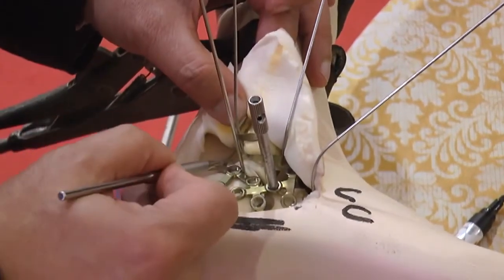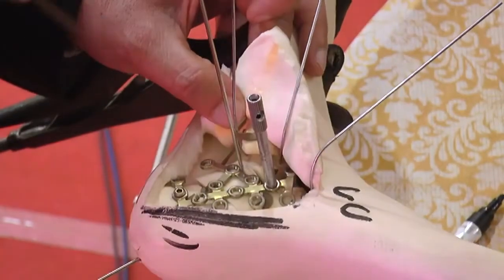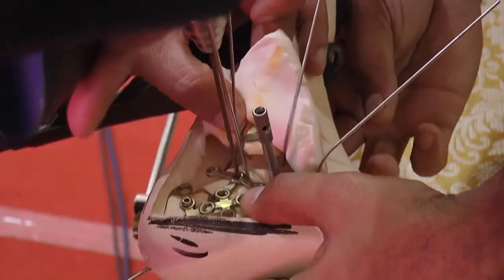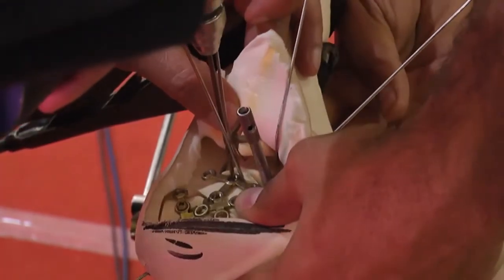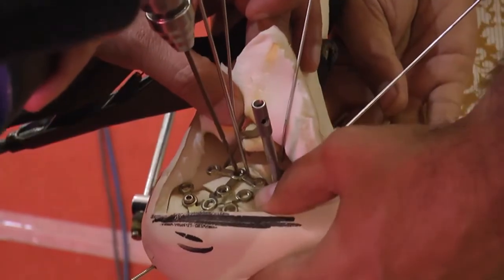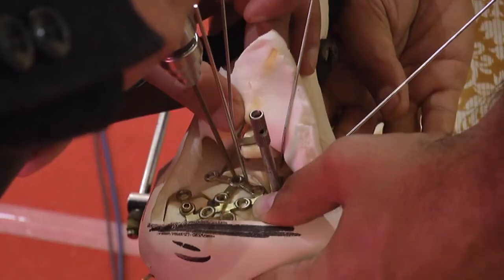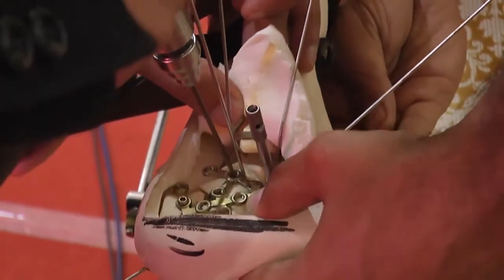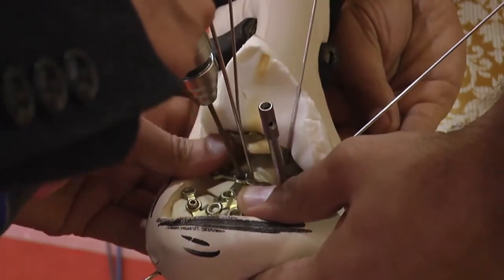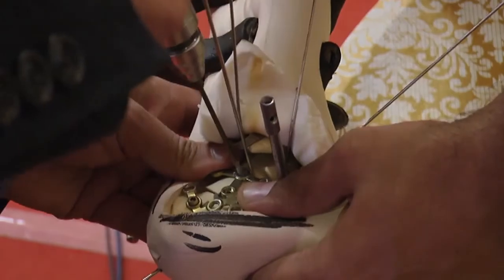That is an ideal location, about 5 to 10 millimeters below the level of the joint, and the direction, obviously, put your drill bit perpendicular and then bend your drill bit posteriorly a bit and plantarward about 10 to 15 degrees. And every time you do this, you do a woodpecker technique, in, out, in, out, in, out, and monitor this drill progress in the C-arm.